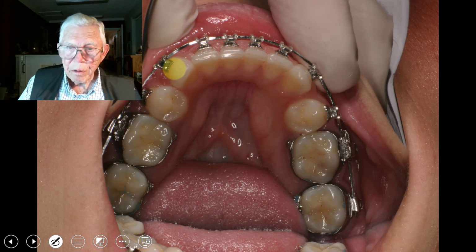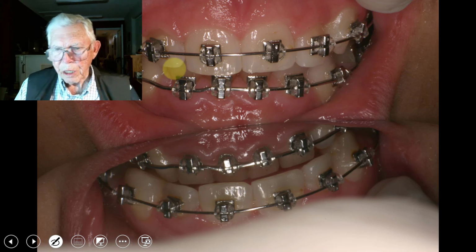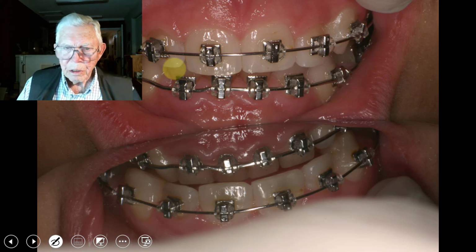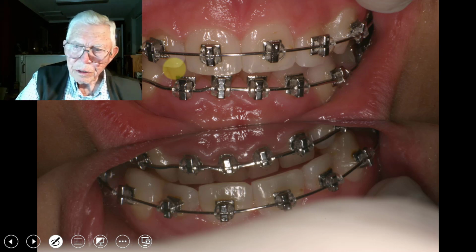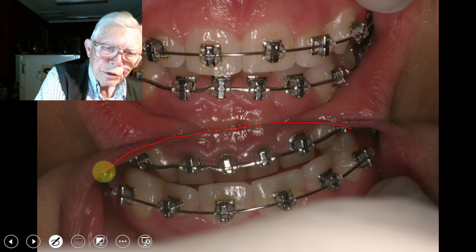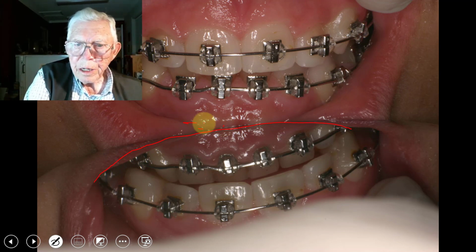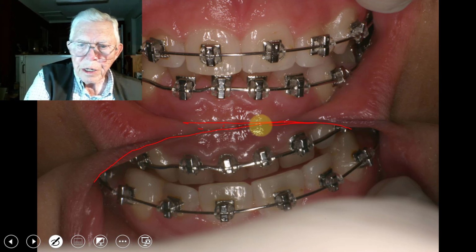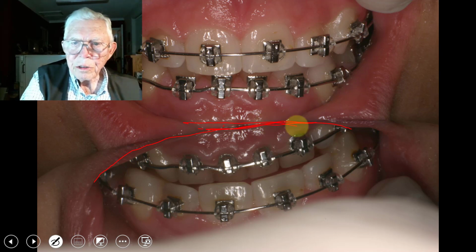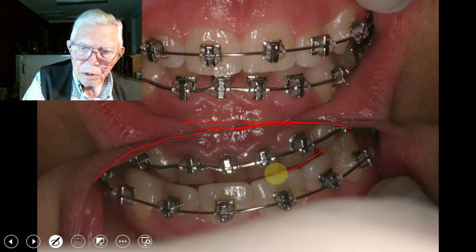Now let's see. Now this is a shot that a lot of people should do. I mean, this is the mirror right here. And I pushed it, set it on the lip, and pushed it kind of up against the tissue right in here. And this is the picture that you get right here. See?